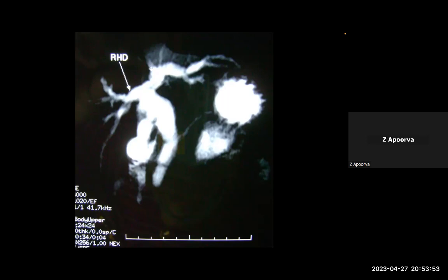Whereas if you have the other type of dilatation, a chain of lakes, non-uniform, with narrow areas and dilated areas, that would suggest some cystic lesion, that is your Caroli disease, etc. Cystic dilatation with chain of lakes appearance. So that is what you mean by progressive tapering, central dilatation, versus non-uniform dilatation. So this is dendritic dilatation, tapering towards the periphery. So what is the type of choledochal cyst or congenital biliary dilatation here?